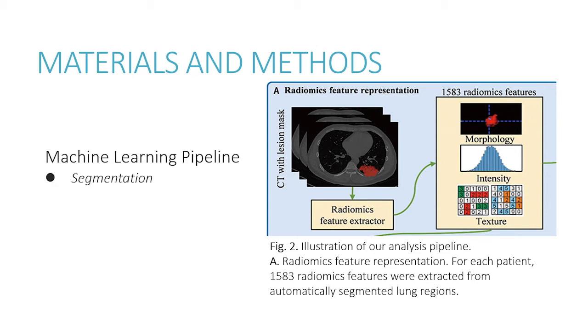First, the lung tissues and the abnormalities caused by COVID-19 were automatically segmented on CT images using a deep learning model based on a deep convolutional neural network. Second, radiomics features were extracted from CT, and a machine learning pipeline utilizing both image-based and clinical variables was used to predict a patient's COVID-19 severity and progression to critical illness at the time of the CT scan.